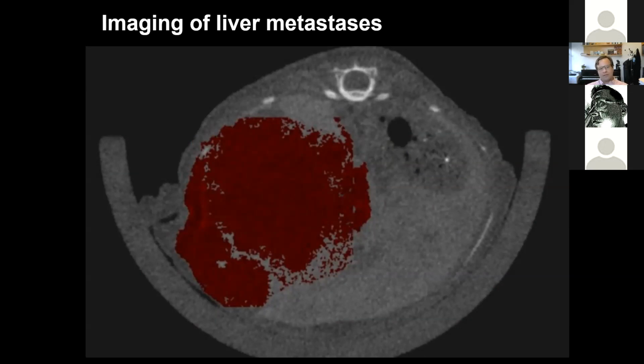I should mention that this CT instrument, because it's so sensitive, is in fact very low dose for a given image. And so even using successive doses, the cumulative dose of radiation that is delivered to the animal is very modest, and as a result should be in the subtherapeutic range.